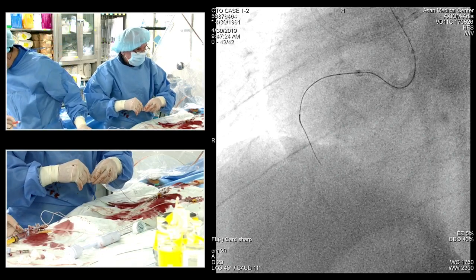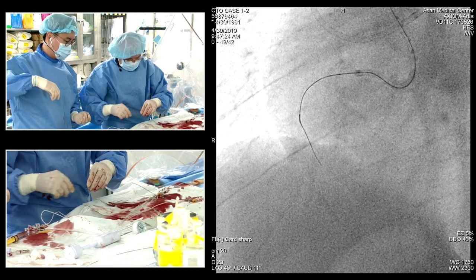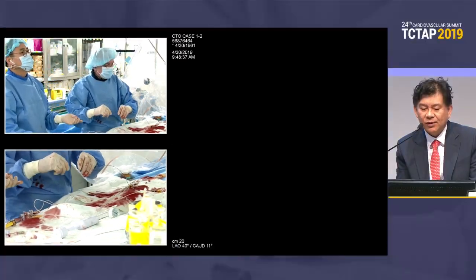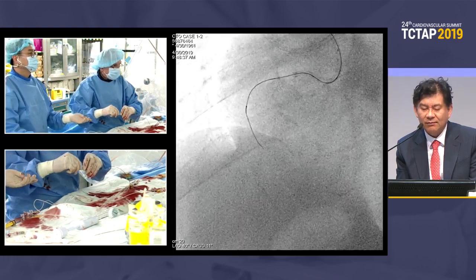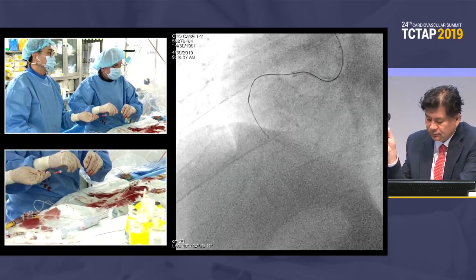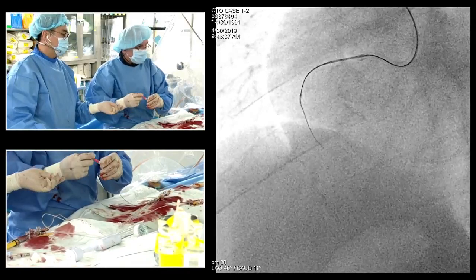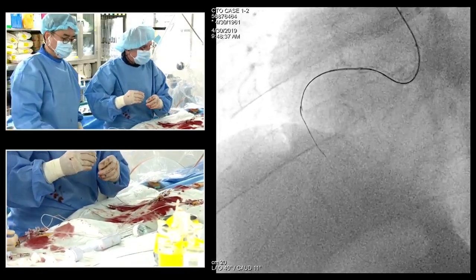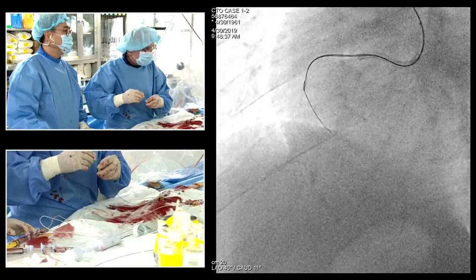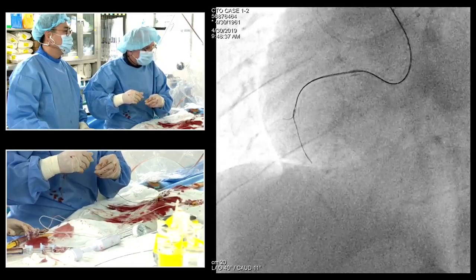Once you failed antegrade, I felt that there's a promising retrograde route from the distal circumflex. Yes, yes. Yeah, so that's my primary. Yeah, looks like a target. More straight and a natural course. Maybe that can be a good source for the bidirectional. Yes, I fully agree. The wire is coming. Yeah. That's nice, because obviously my eyesight is getting bad with age.